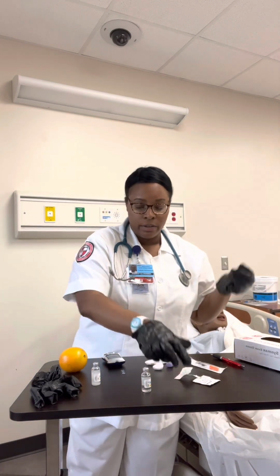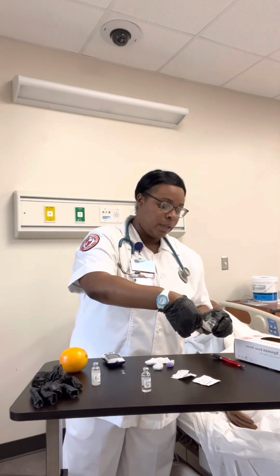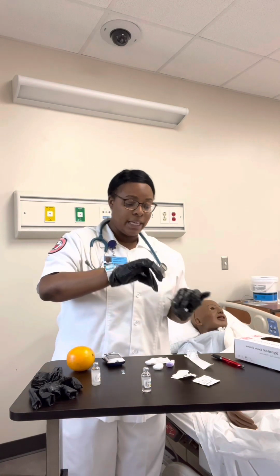First, you will wipe the skin with an alcohol swab in a circular motion and allow it to dry. You would then pinch the skin. If you could pinch 1 inch of skin, you would inject at a 45-degree angle. If you can pinch 2 inches of skin, you would inject at a 90-degree angle. We're going to pinch 1 inch and inject at a 45-degree angle.